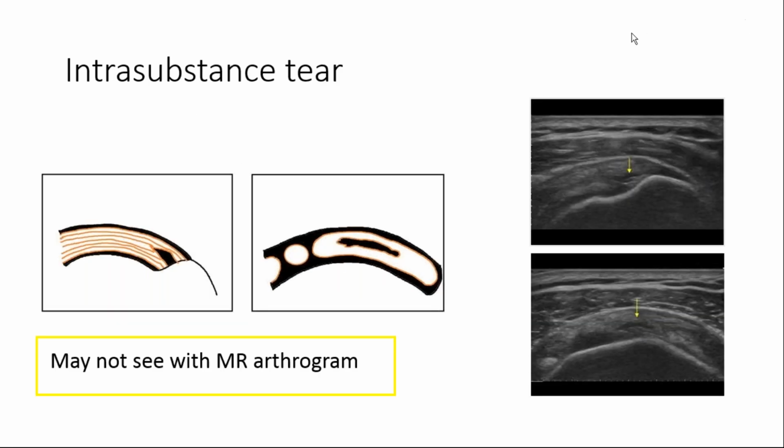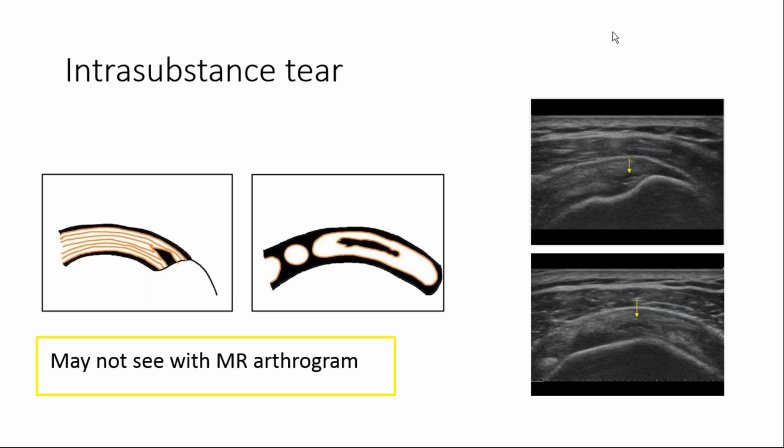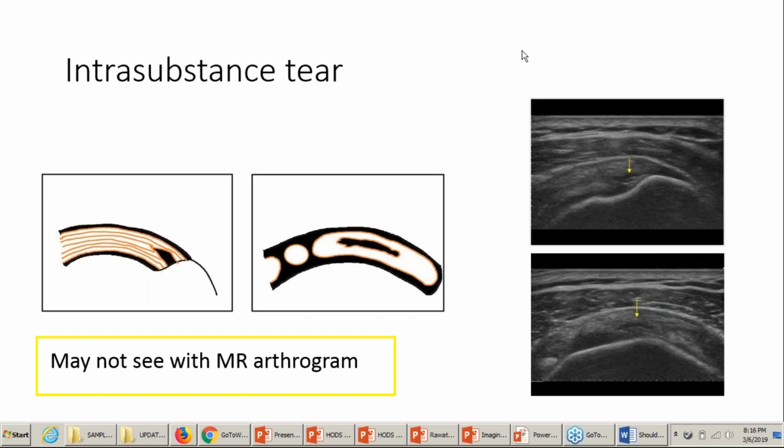Now we have another partial tear, which is mid substance or intra substance. This tear is right in the middle here in the long axis. In short axis, you again confirm it. Now let's try to formulate an impression for this one. Anyone? There's sonographic evidence of a hypoechoic signal that is consistent with an intra-substance tear in the supraspinatus tendon, and we didn't measure it.